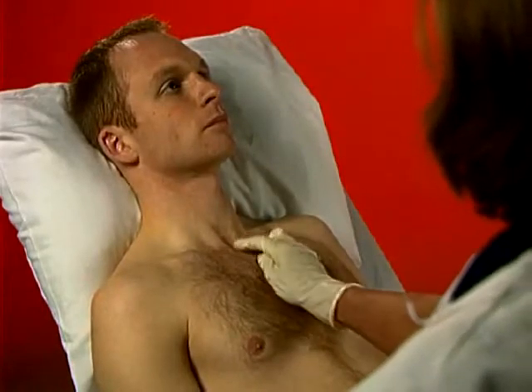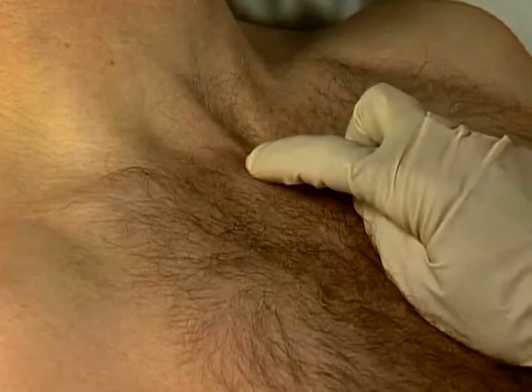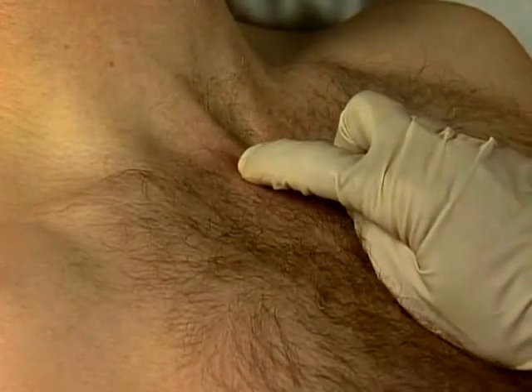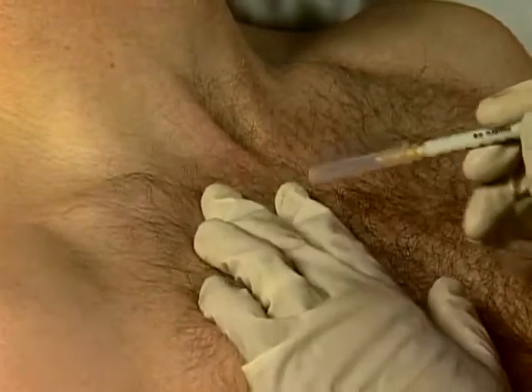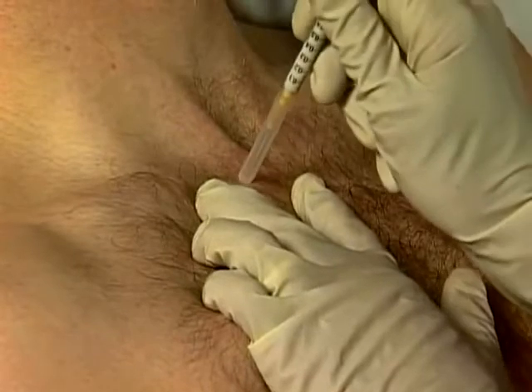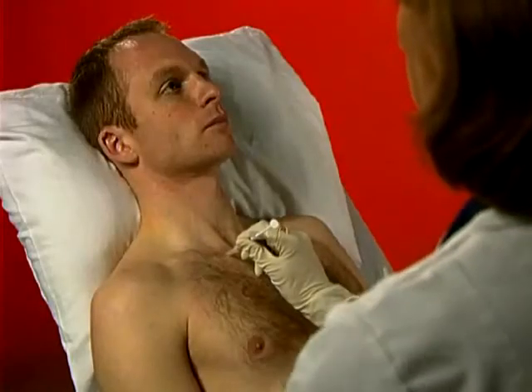Identify the top of the sternum. Move laterally until a small dent is found at the proximal end of the clavicle. Mark entry point at joint line. Clean and firmly stretch skin and rapidly insert needle perpendicularly. Angle upwards and medially, aspirate and inject as a bolus.